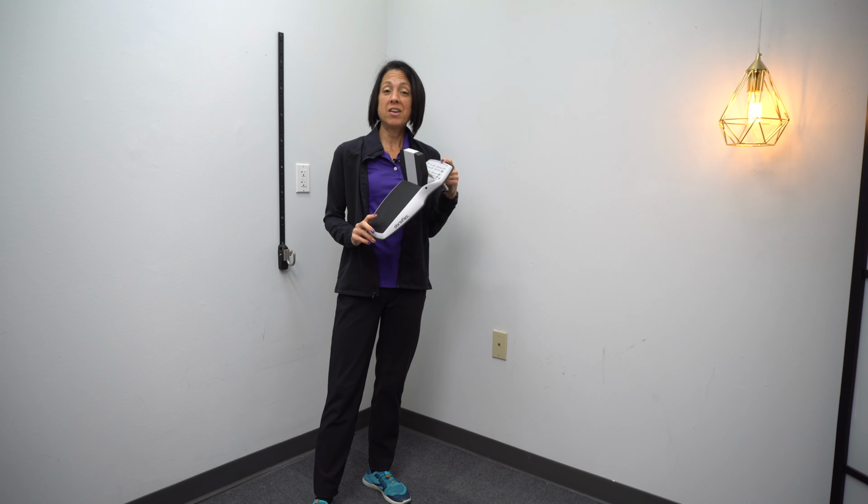All right, and then the next tool we're going to go over, and this is a relatively new tool that I found on Amazon, is kind of like a toe stretcher.